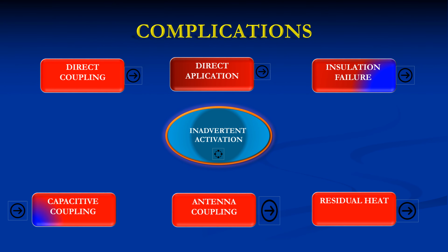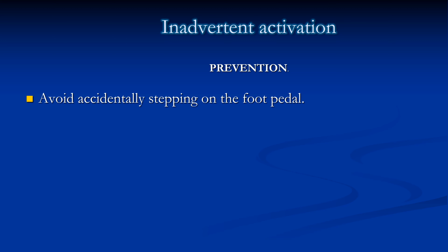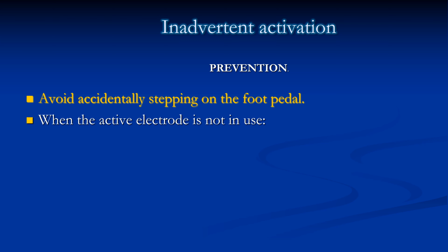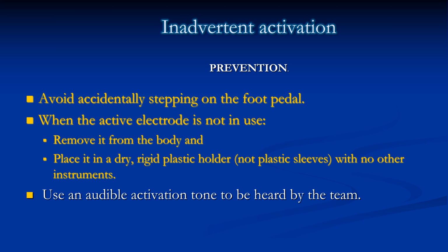Overview of complications. Inadvertent activation can lead to unintentional patient burn. A prevention strategy is as follows. Avoid accidentally stepping on the foot pedal. When the active electrode is not in use, please remove it from the body and place it in a dry, rigid plastic holder, not plastic sleeves, with no other instrument. Use an audible activation tone to be heard by the team.